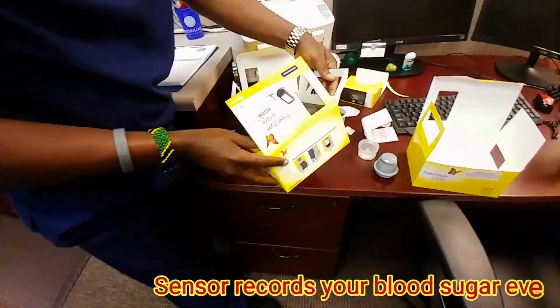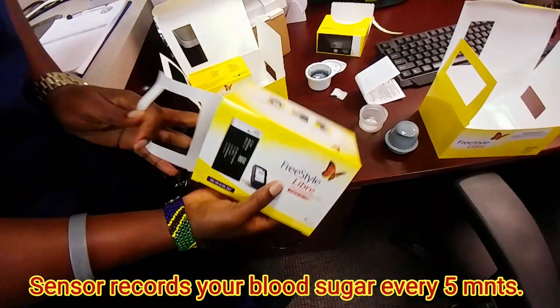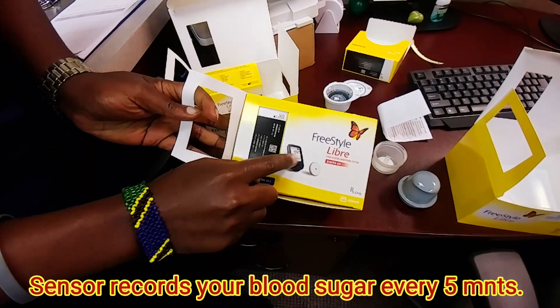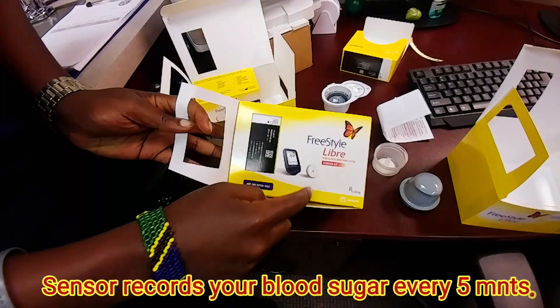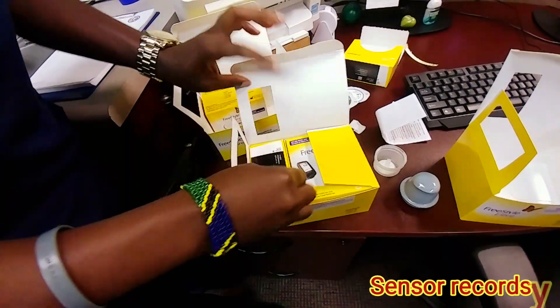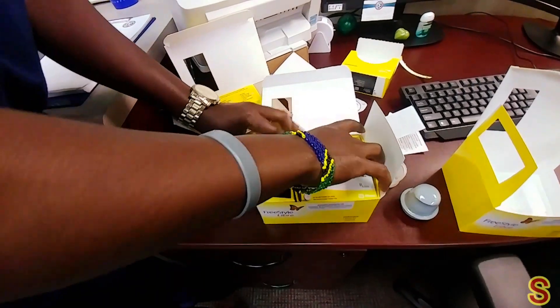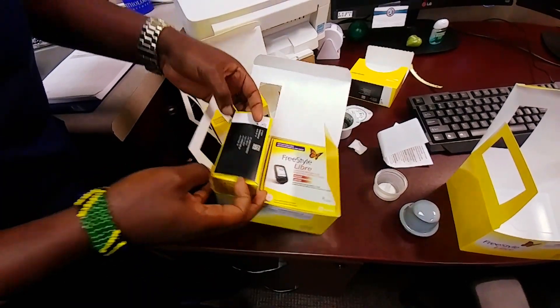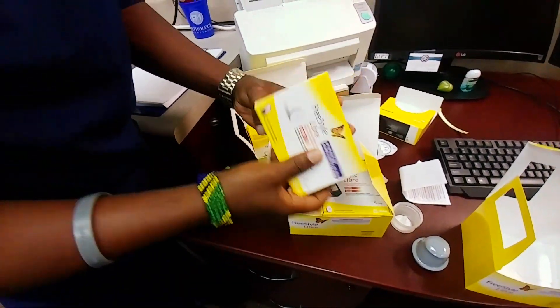Here's the box. He's going to open it up. Inside the box — Sabas, what do we have in there? We've got the reader and the sensor. Reader and the sensor. There's the sensor.